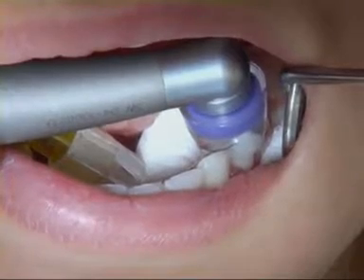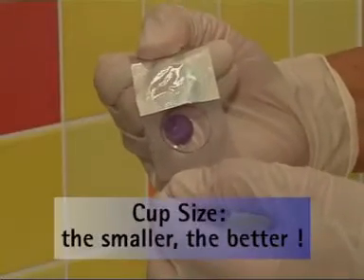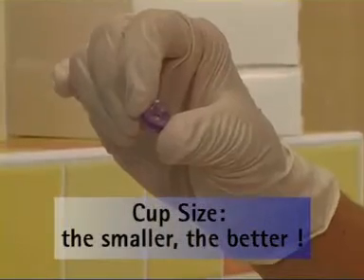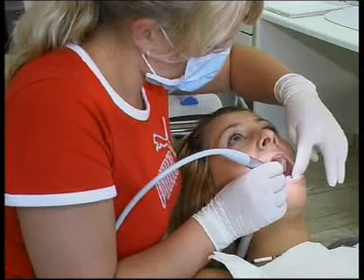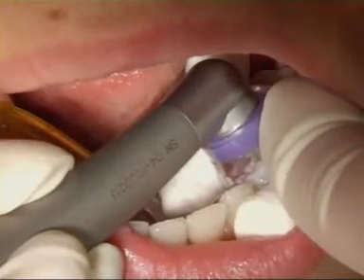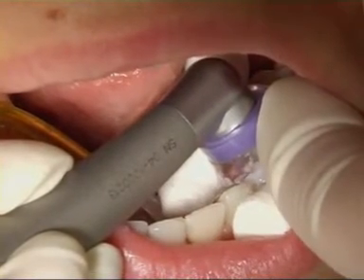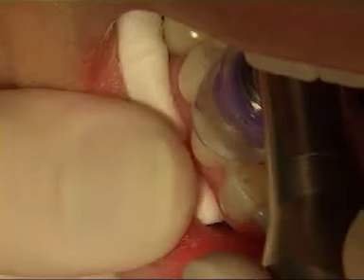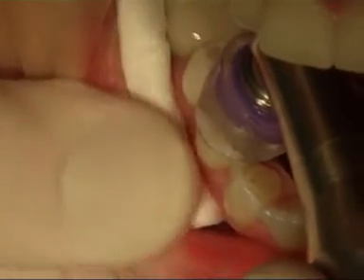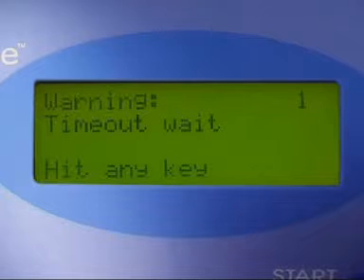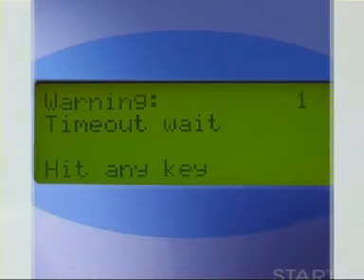A word of advice: try not to choose a cup that is too large — the smaller, the better. You can also mold the cup with your finger and press it down onto the tooth. If a vacuum cannot be created, treatment will be interrupted after 60 seconds and a warning message will appear on the display.